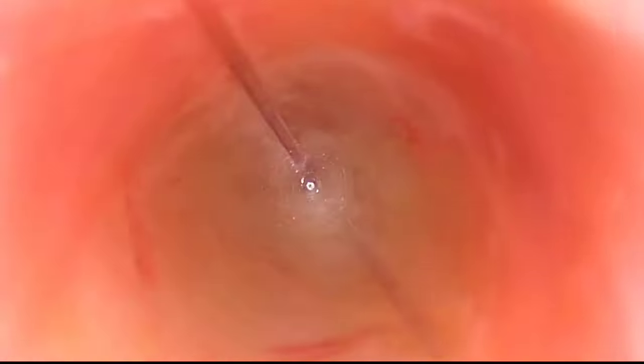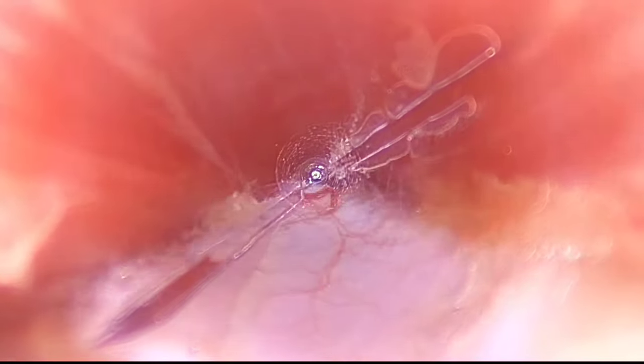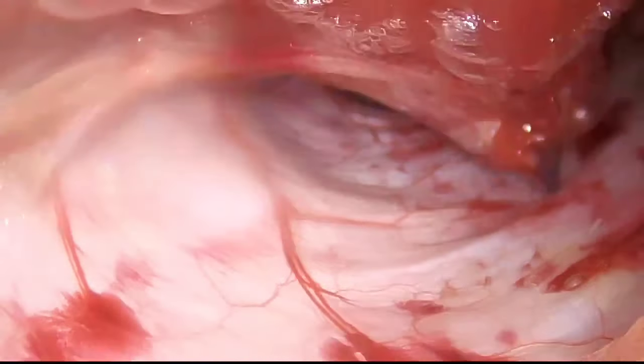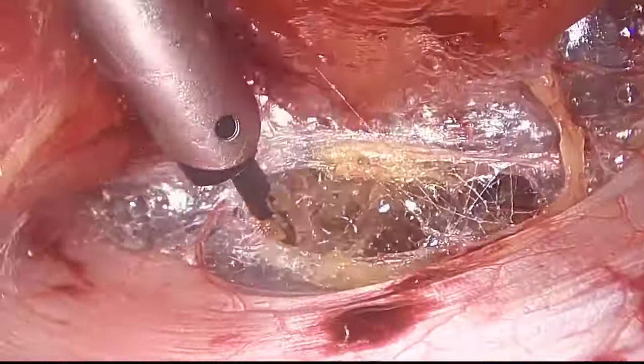So I started to gain the retrorectus access on the left side using the OptiView technique. So layer by layer penetration, and now I'm in between the rectus muscle above and the posterior rectus sheath below. After creating some pneumopressure, further dissection was to create and enlarge the retrorectus space using hook dissection.